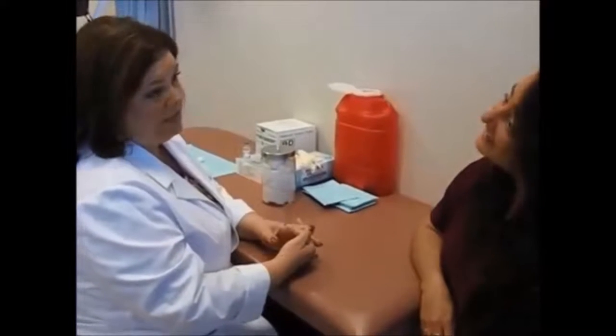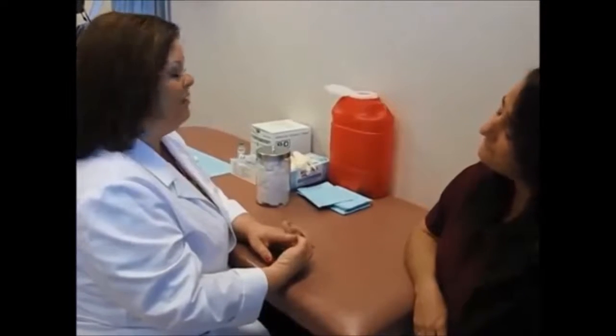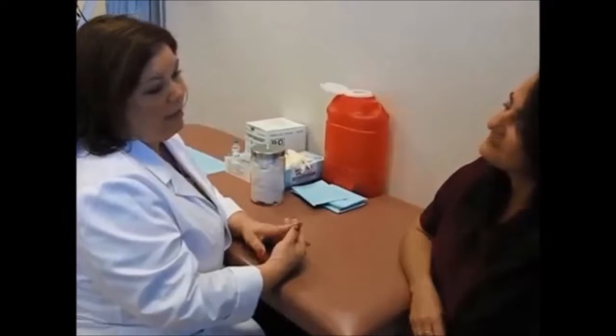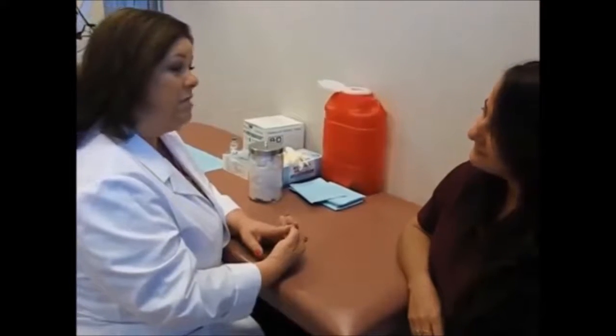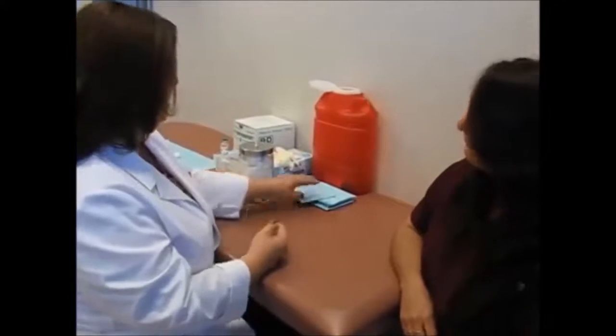As you know, this is a test for your employment admission for your great new job, and I need to have you come back in 2 days to read the results. I could see you either on Wednesday or Thursday. Let's go Thursday. All right.